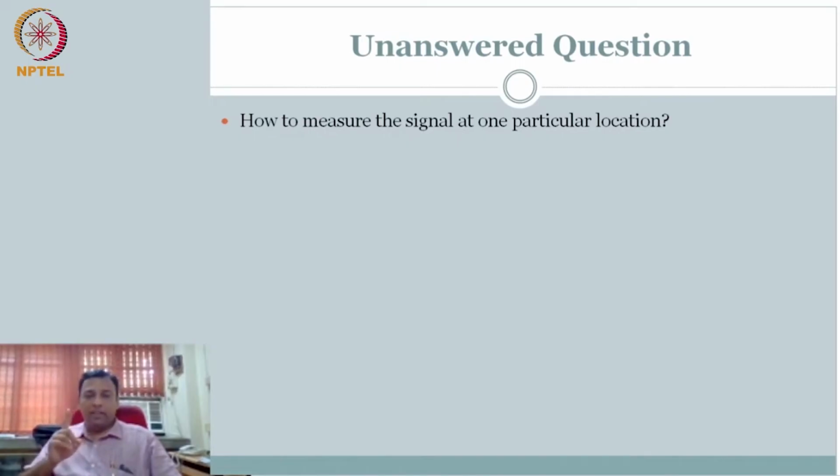And we described that if we are biomedical, we are interested in the hydrogen proton. The hydrogen proton had one gyromagnetic ratio. That gives the Larmor frequency, which is unique for hydrogen, some 42.8 megahertz per Tesla. So you have a signature Larmor frequency, and I want to see how the hydrogen or proton density is distributed in the body. So the logic would be straightforward.